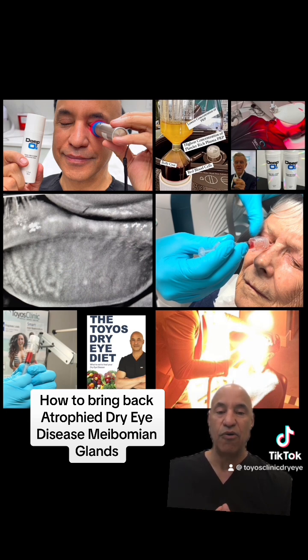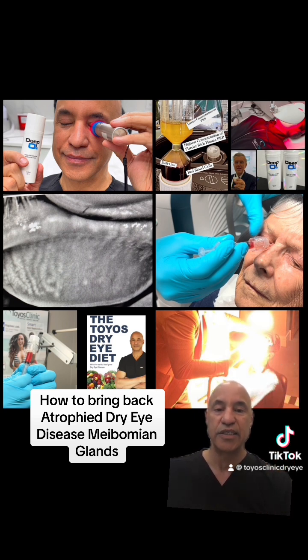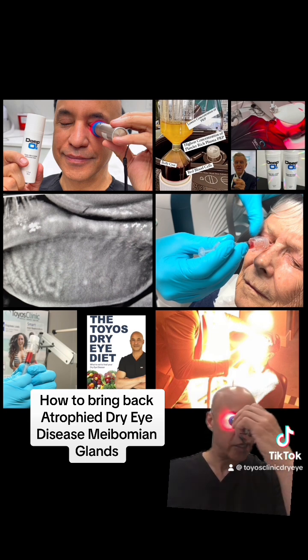What do we do at home to give those glands energy and keep them working? That's where we use low-level light treatment — red light. That's the picture you see way up there to the left, and also the light utilizing the mask. Using an at-home light treatment right onto the glands. This is the CUE, which is an at-home light treatment that I have patients use.